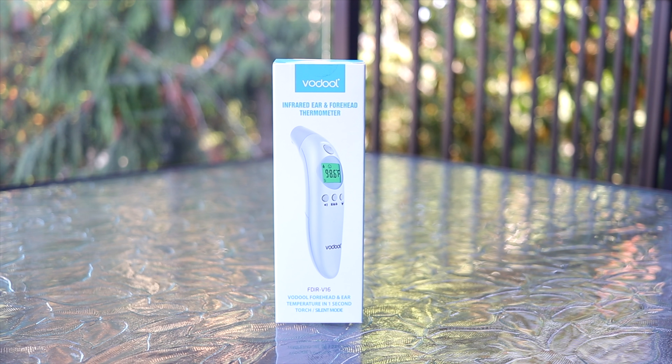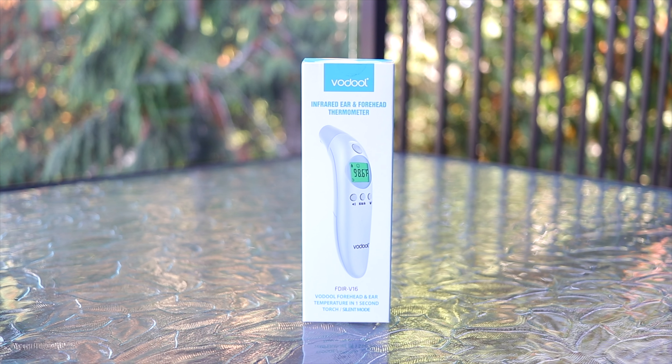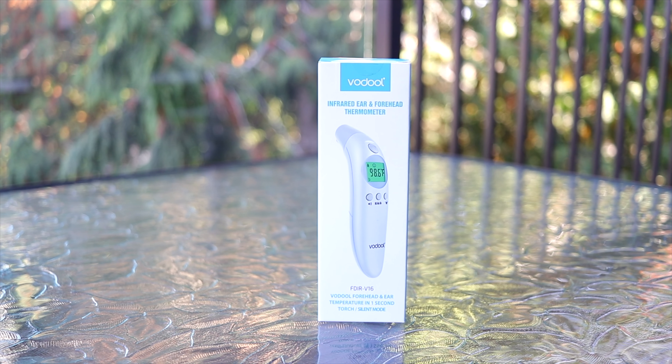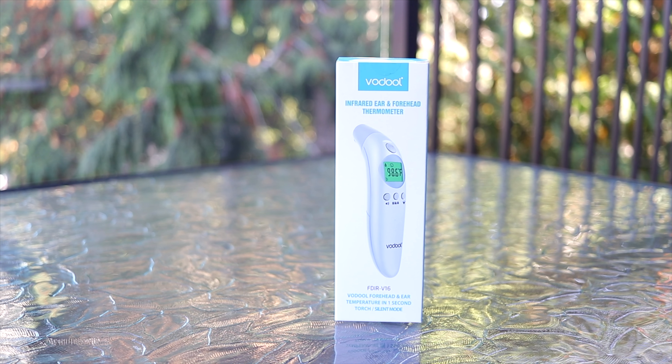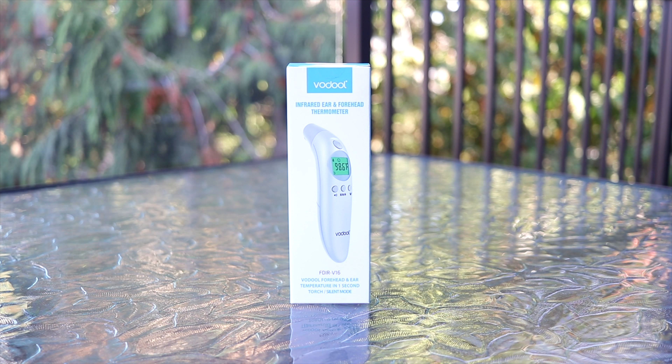This is the VoDuel Infrared Ear and Forehead Thermometer — a very high quality instant thermometer, no waiting on this one. Before we get started with it, let's go ahead and unbox it.